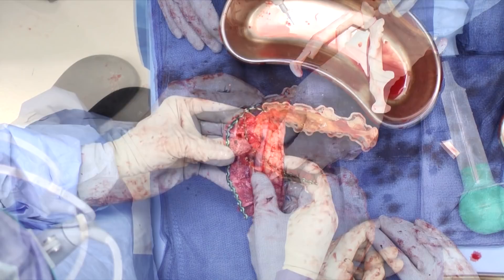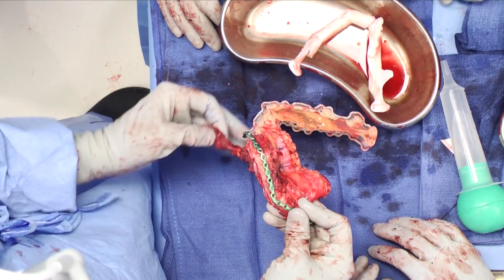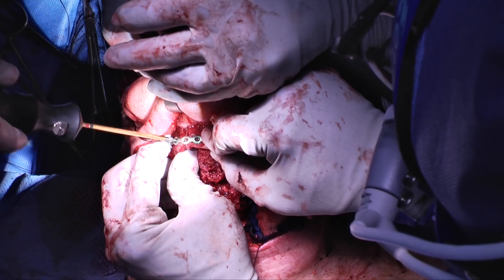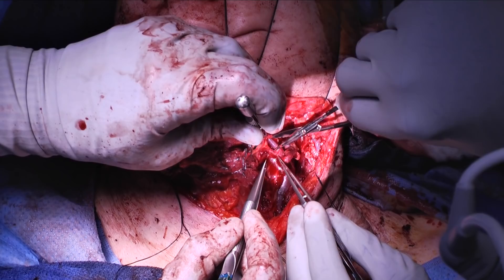A final check against the cutting guide ensures the flap is in its proper orientation and size. In this flap, the vessels are going to be brought anteriorly to the opposite side of the neck; the pedicle is shown here inferiorly. It could be brought to the ipsilateral side of the neck as well, or the flap could have been designed to have the vessels come out more proximally. The skin paddle in this patient is going to be brought out medially and used intraorally. The preformed flap attached to its plate is then inset into the patient with monocortical screws, and skin insetting is done with mattress Vicryl sutures.